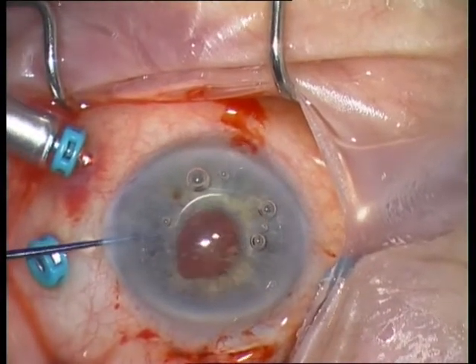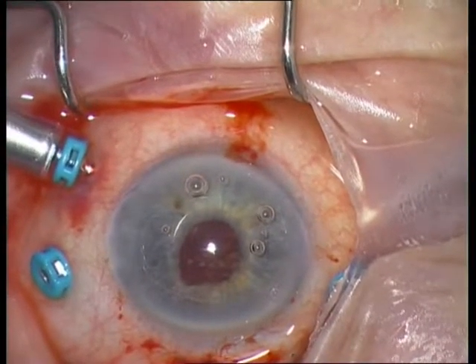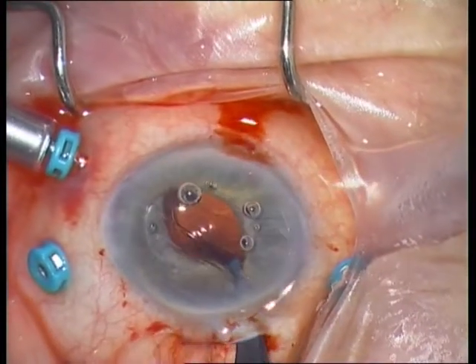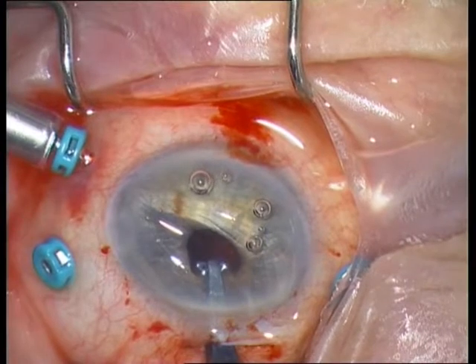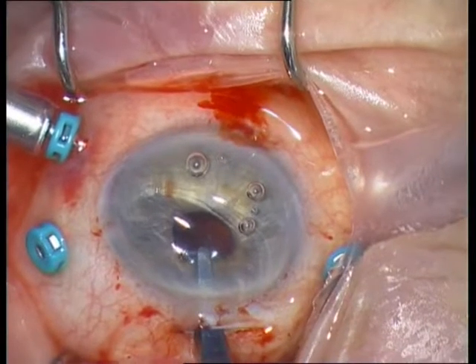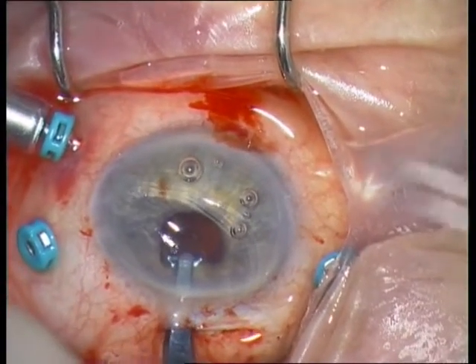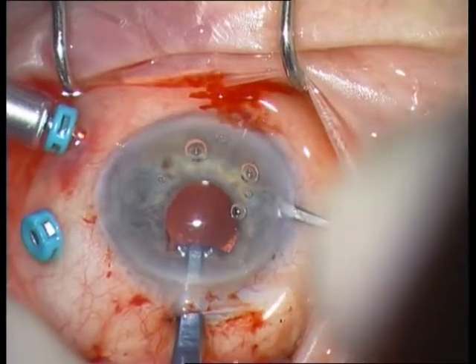Again with the rotator for centration of the IOL. This is the IOL forceps, also included in the AMO instrument pack. Flip the IOL behind the iris and enclave the iris tissue with the iris spatula. Gorda has a special instrument for this maneuver. Repeat the same on the other side.